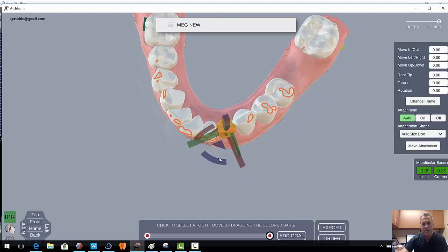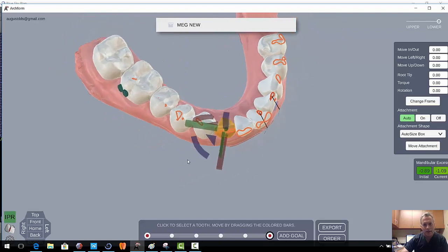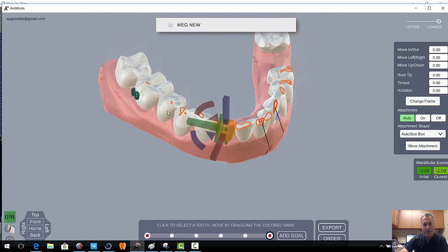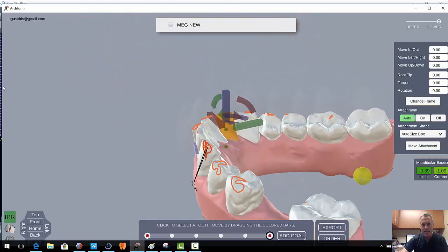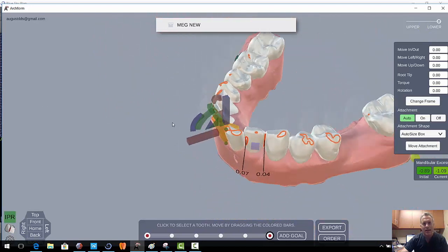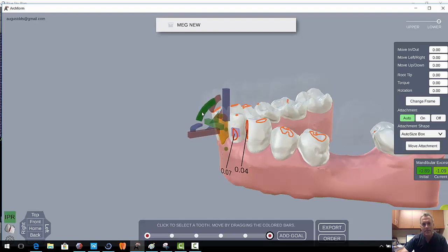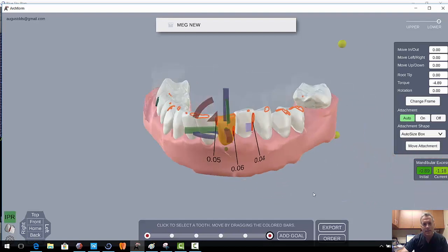I'm going to start with this tooth here, and we're just going to rotate that in line with the canine. We'll do the same thing on this tooth here. Looks like the rotation is actually pretty good, and the position of those teeth are pretty good as well. So let's try to emulate that with number 24 and 25. So we're going to move that tooth up a little and move this tooth up a little bit.